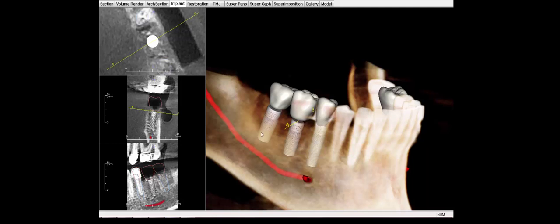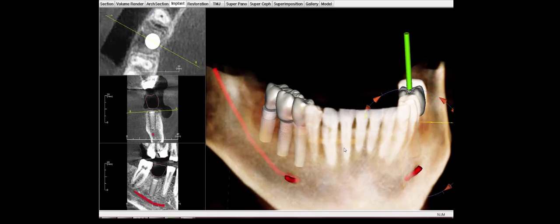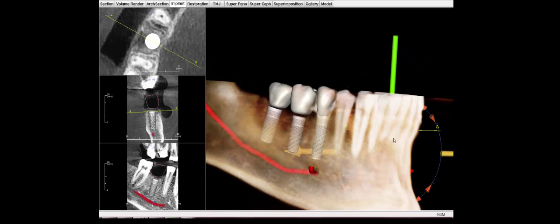That's a key element in having implants that last a very long time is having enough bone on the outside. Typically, at least one to two millimeters is ideal. You'd be surprised how difficult it is to get one to two millimeters. Here I'm measuring 10.22 millimeters. Why do I have that volume of bone? Because the timing of this case was done right.